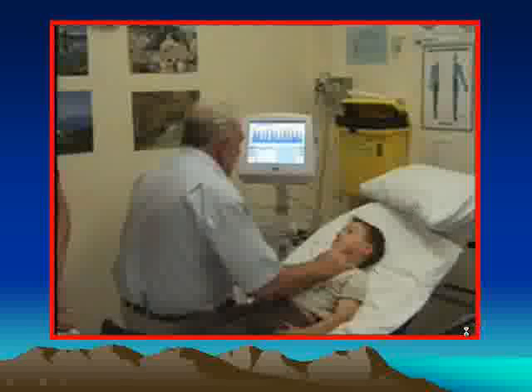Well, let's measure his stroke volume. This is using the sternal notch, looking down at the aortic valve, and we're measuring his stroke volume beat to beat in real time. His stroke volume is about 28 mils. Now we get Mum to raise the legs. His stroke volume increases to 34 mils, a very useful increase in stroke volume. He must therefore be on the underloaded side of the Starling curve. He will respond to preload.